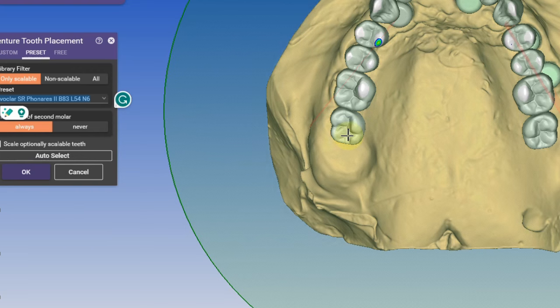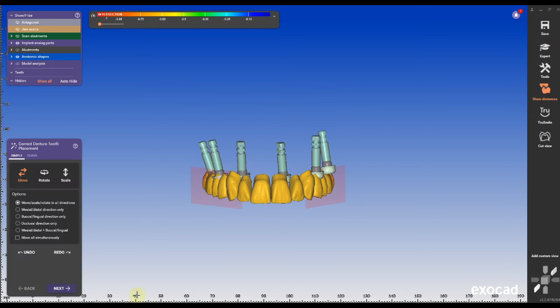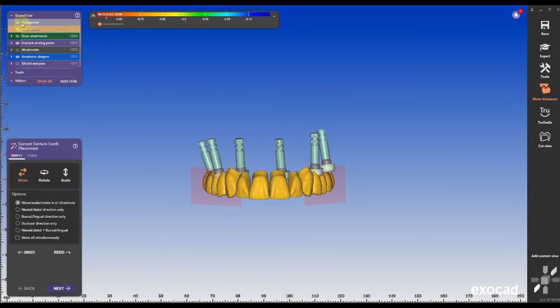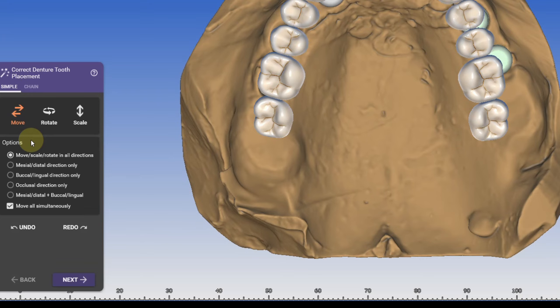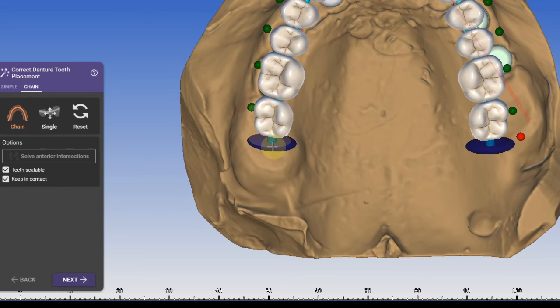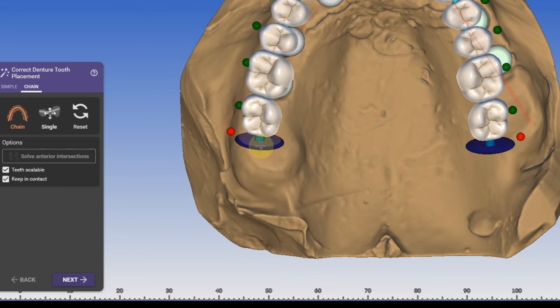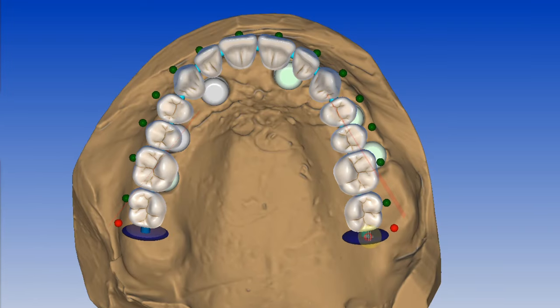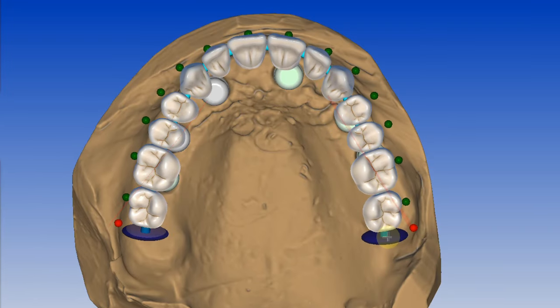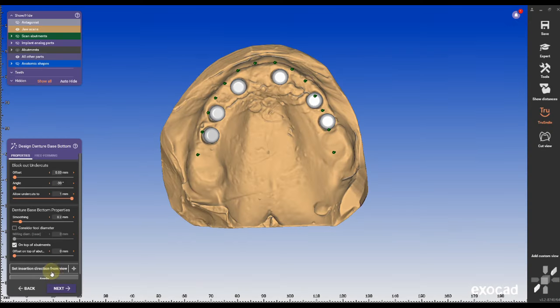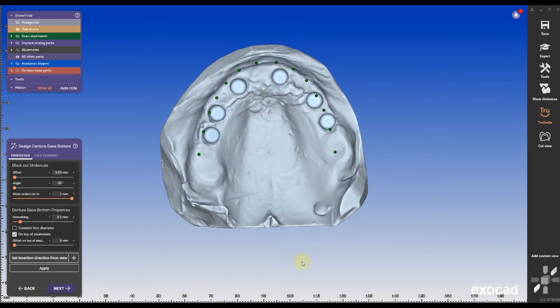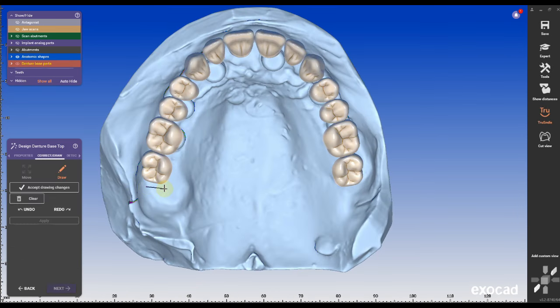In the chain mode just drag the teeth into the desired position and make sure the locator housings are either under the teeth or more towards the lingual. I will be designing a locator fixed denture today. This is basically an all-on-four restoration retained by locators.